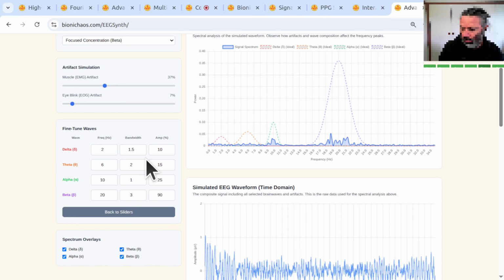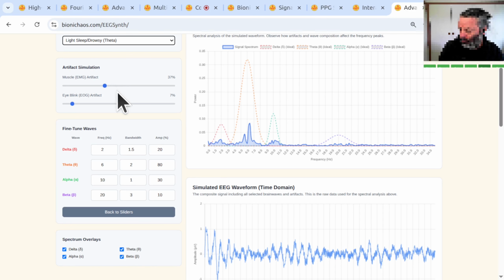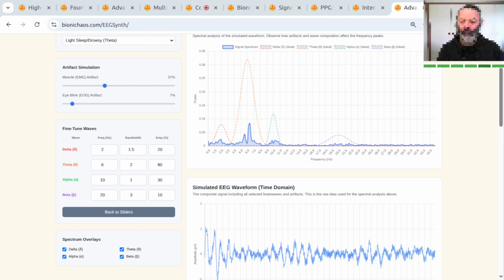And what about how different brain areas talk to each other? For that, we can use something called the directed transfer function, or DTF. It's like an advanced version of Granger causality, basically telling us the direction of influence between brain regions, even if their activity patterns overlap a lot. Wow. Okay, so these aren't just abstract algorithms. Where are they making a real difference right now?